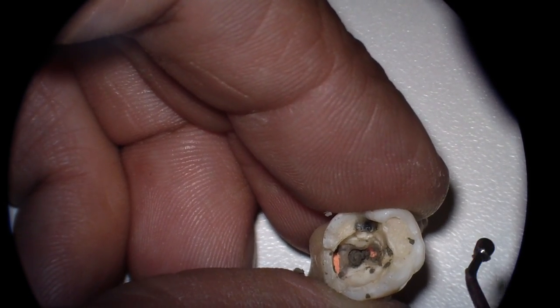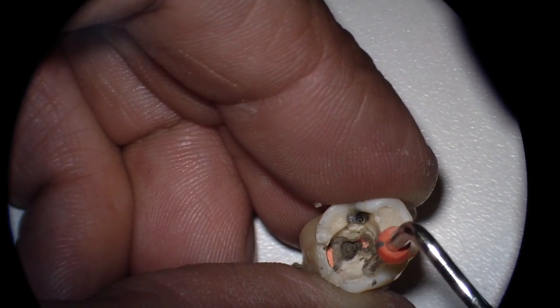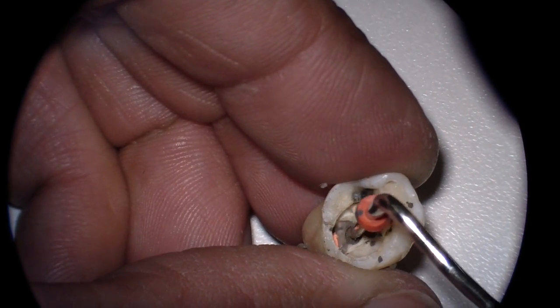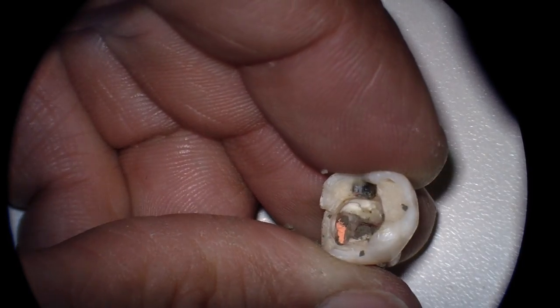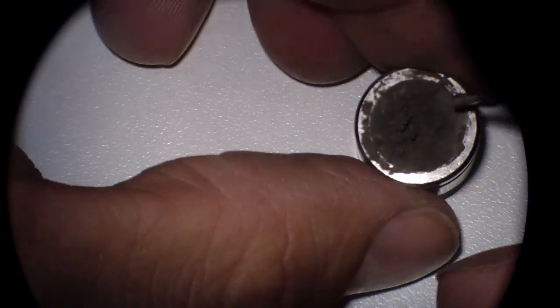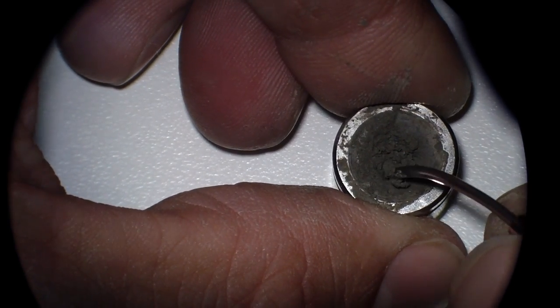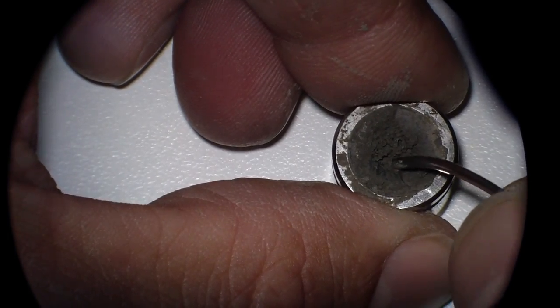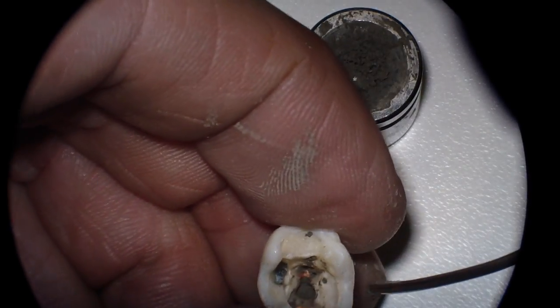Because once it's set — say you've determined that pulpotomy is sufficient for now, you've repaired the perforation, and you want to come back for another appointment — if MTA goes down into the canals, ooh, painful. That has not happened to me, luckily. So again, placing paper points into places you don't want MTA to go is probably a helpful solution.